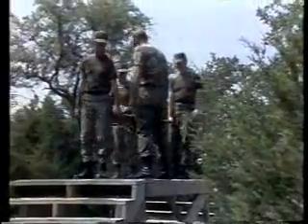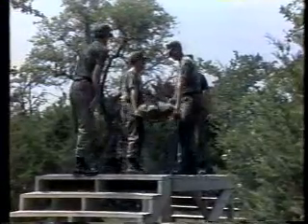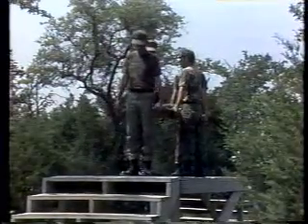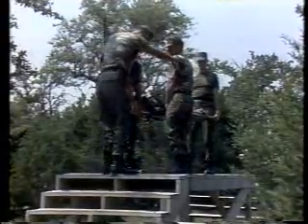In this case, the team is about ready to move downstairs, which essentially means that they're going downhill, and they again need to rotate the patient, again keeping the head closest to the surface of the ground. Here, the weight is shifting to the front of the litter as they go down. Team leader provides support as they move down the steps, and also the front team members will work to keep the litter level. Again, they go back to the 4-person carry.